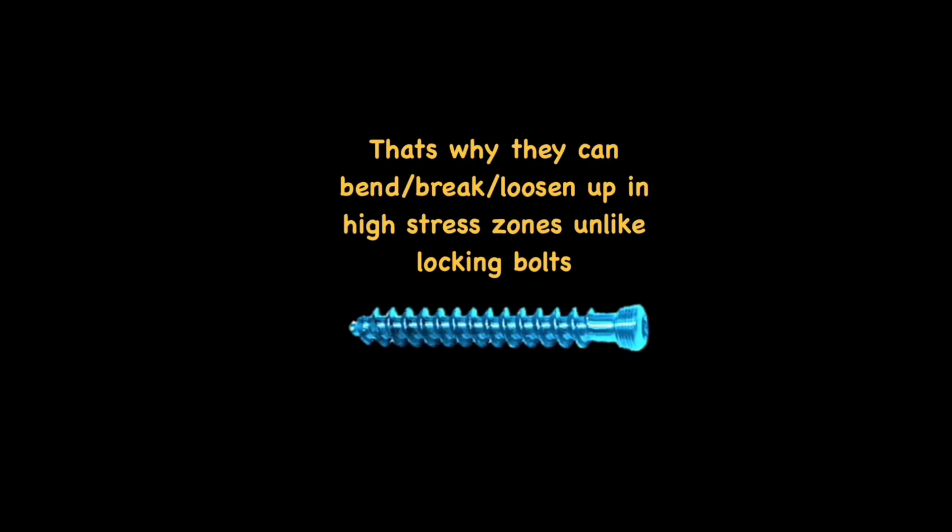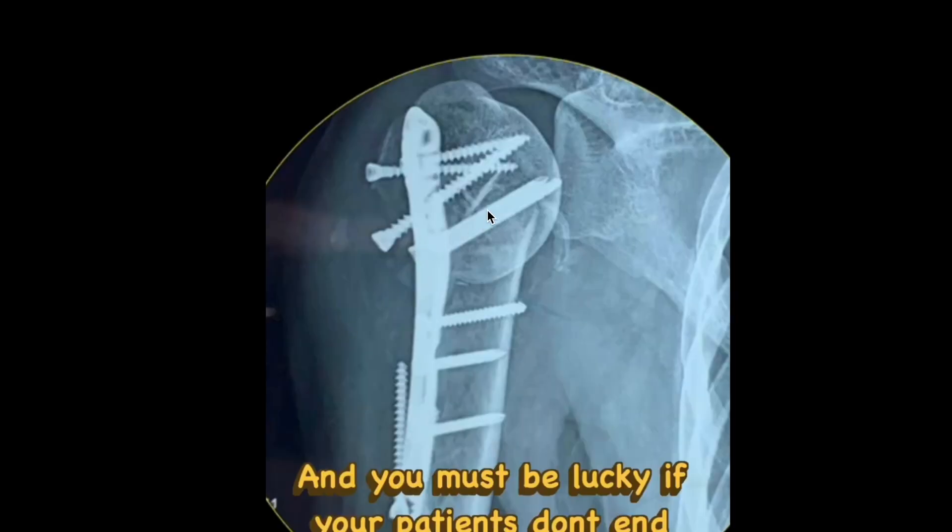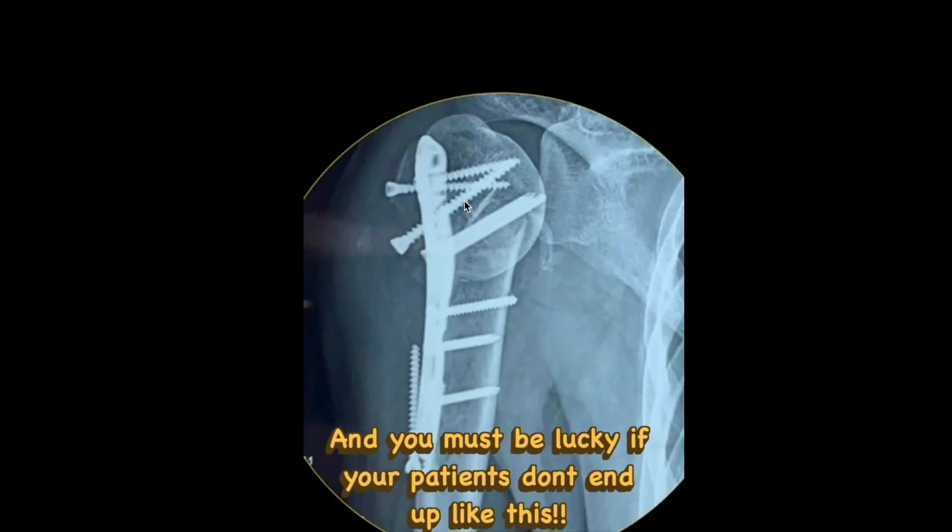These are zones which absorb a lot of stress. If we try to put locking cancellous screws, we are actually compromising the fixation strength. Here is an example case: the locking cancellous screws have all loosened up, while only the conventional locking screws placed in the diaphyseal zone remain in position. One of the locking screws has migrated — this is something which can happen.